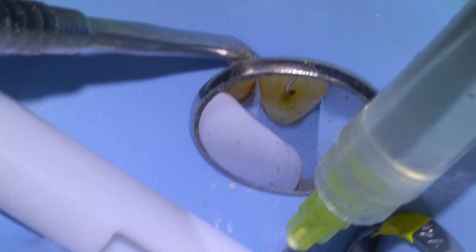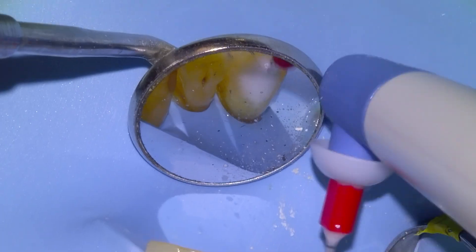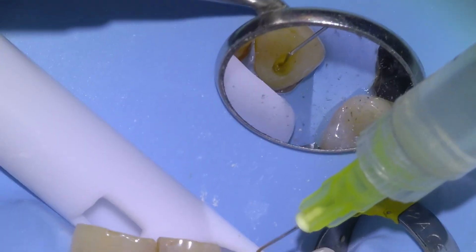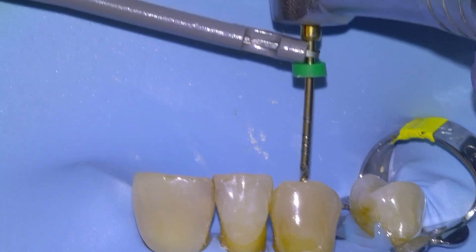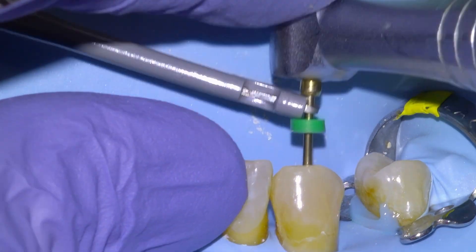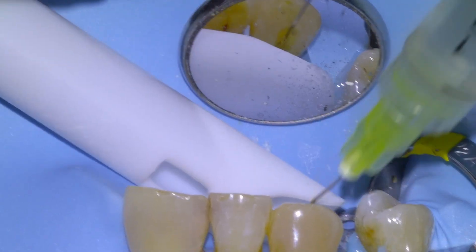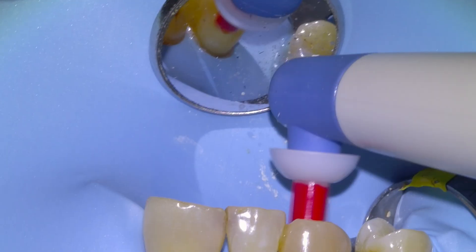With RC Prep I'll always use an endo activator for the last two files, going in with the activator for about 15 seconds and then irrigating again with hypochlorite. You can see the tooth is dark, indicating it has been necrotic for quite some time. This is our final file — a 35/04 — taken down to the green line. We have a good apical stop and that concludes the preparation. We do a final irrigation, activate once more, and in this case I decided to take a cone fit radiograph.